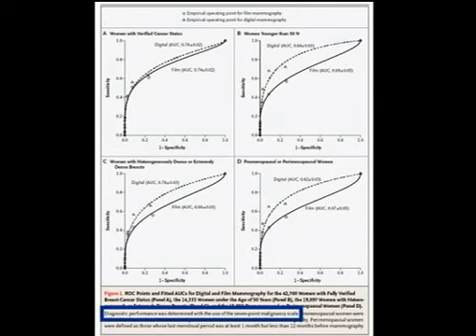And their whole argument centered around this figure, Figure 1 from the New England Journal paper. What we're going to look at here is the diagnostic performance in terms of an ROC curve that was developed using that 7-point malignancy scale from the radiologist. Now recognize that an ROC analysis attempts to incorporate both the sensitivity and specificity of the exam, or the interpreter's ability to call true positive results and true negative results. So this is a combined analysis as the ROC curve.